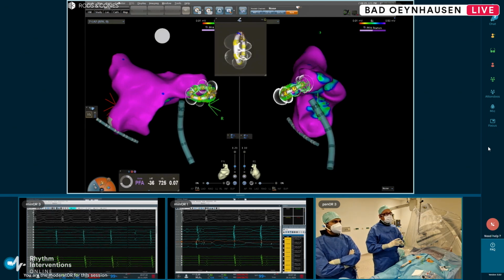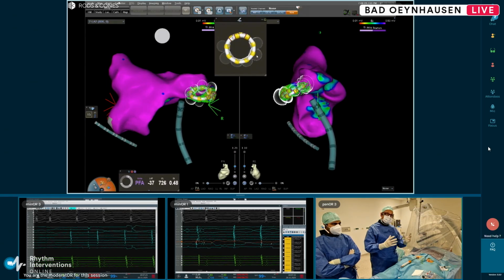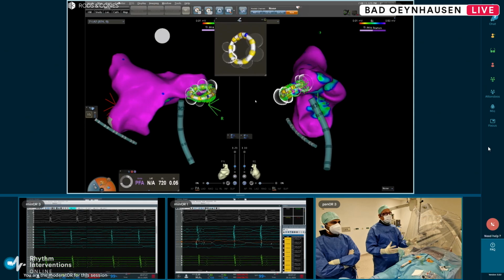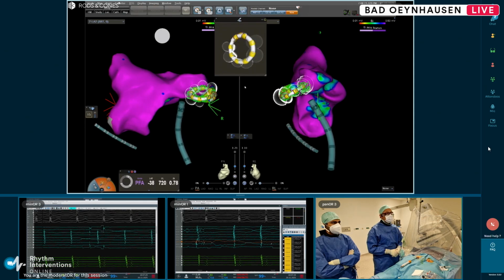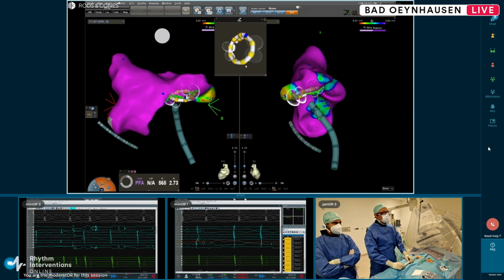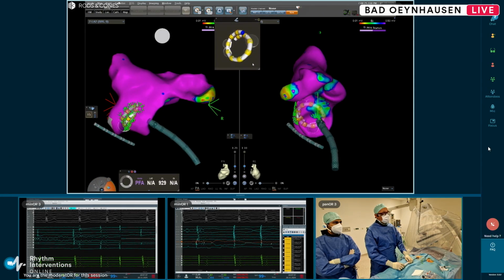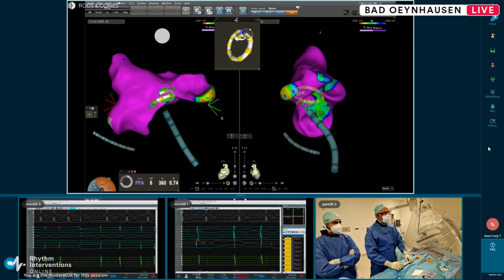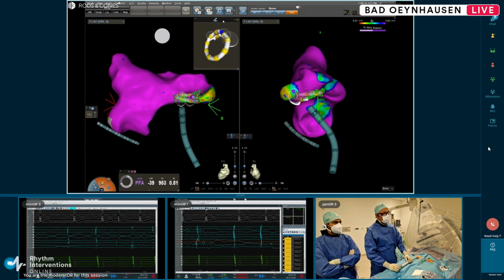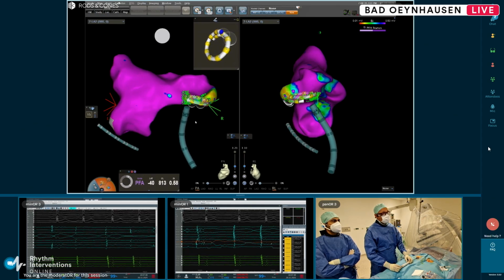And you will also see that this TPI measurement then correlates with a kind of a grid cloud, which allows you to understand that good TPI finally results in a nice, straightforward lesion. And while we do so, I can also give you the information from the MRI data we have, that when you finally have good TPI, then you also see lesion formation in the MRIs of the patients 3 months after ablation. So this is really a good measurement tool.